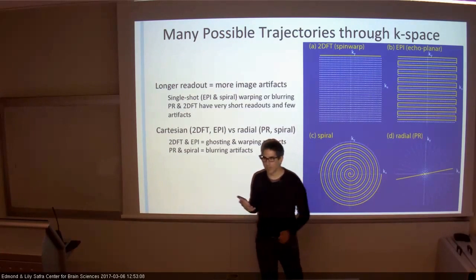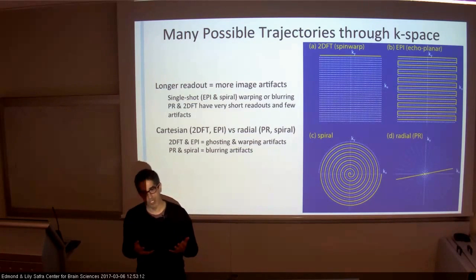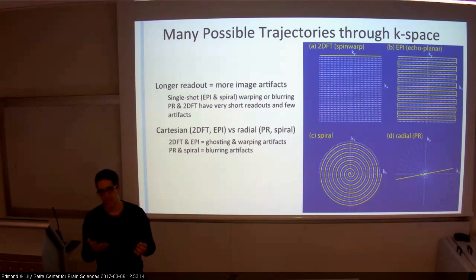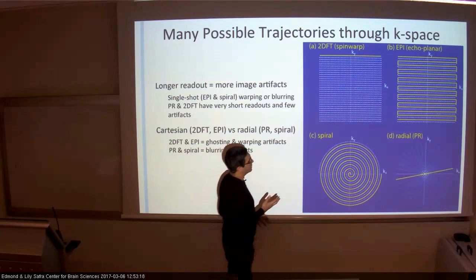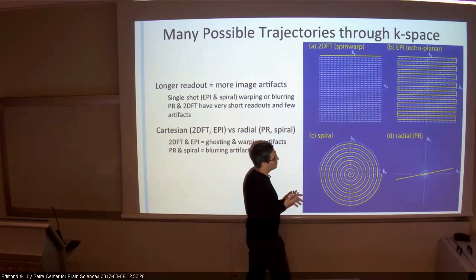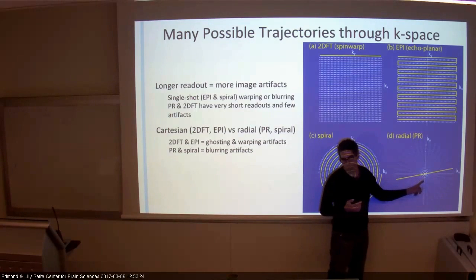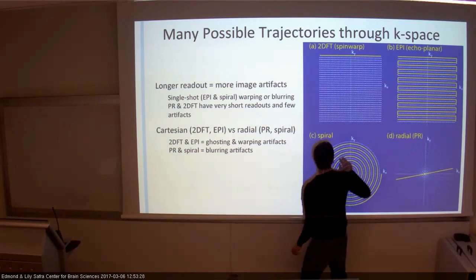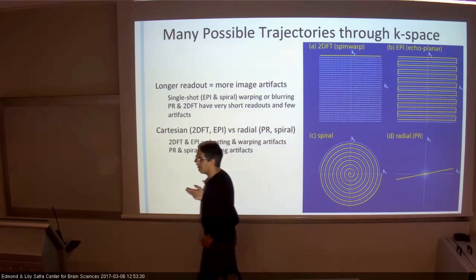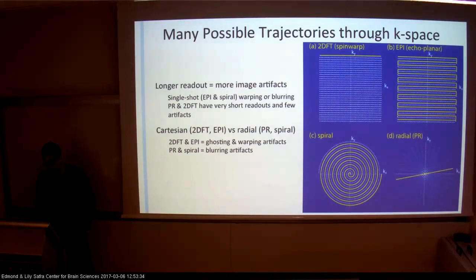We can write the equation, which we didn't, that will allow us to do this manipulation in K-space, and then sample. This sampling scheme will get us more or less information. For instance, this radial one will create one kind of artifact. This one will get us a different kind of artifact, and so on. And that's important: ghosting versus blurring, and so on.